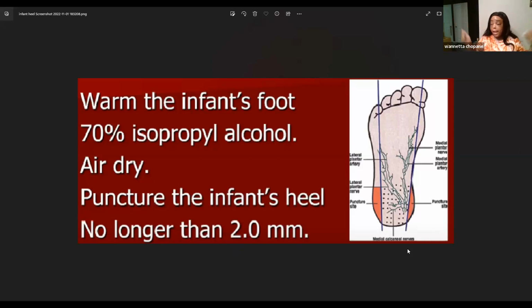It doesn't matter unless your patient tells you, oh, baby, just stick this hand. I do knitting with this hand and I use it a lot, you know. So whatever, if your patient tells you, then, you know, just give them their wish. But it doesn't matter in actuality which hand, as long as it's the third and fourth fingers, okay? And the lateral medial parts of the heel for the infant, okay? Any other questions?